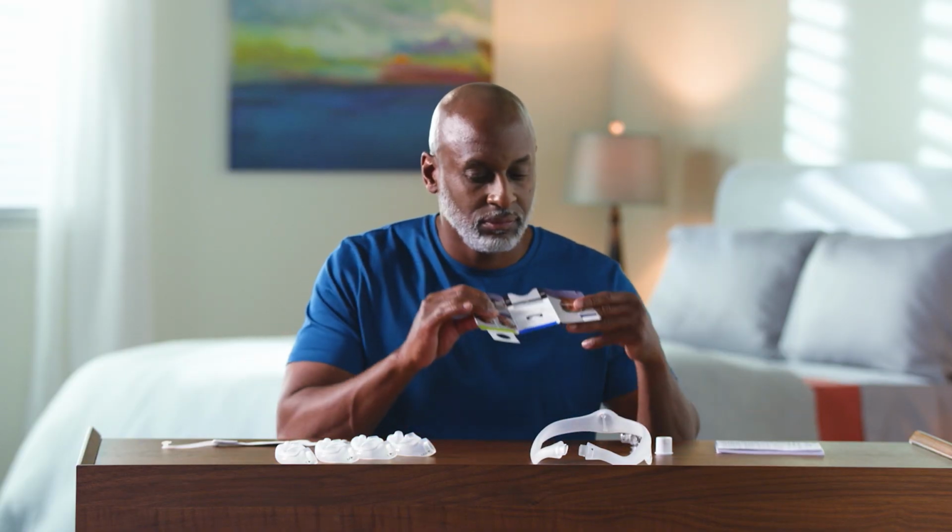In front of a mirror, hold the gauge horizontally under your nose. Choose the smallest size that will cover your nostrils and tip of your nose. In this case, a medium.